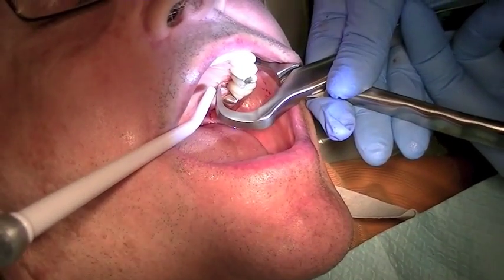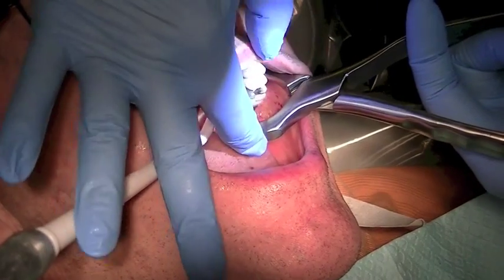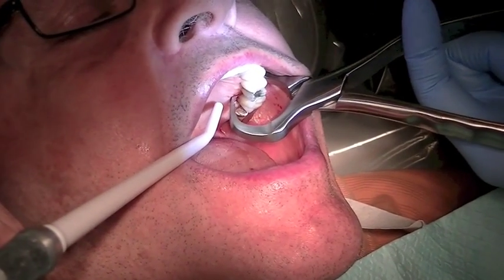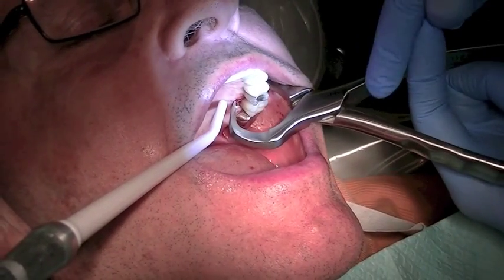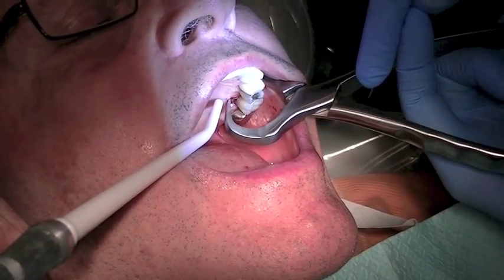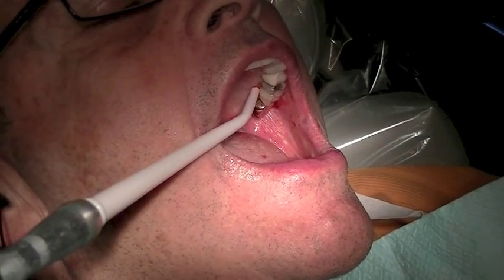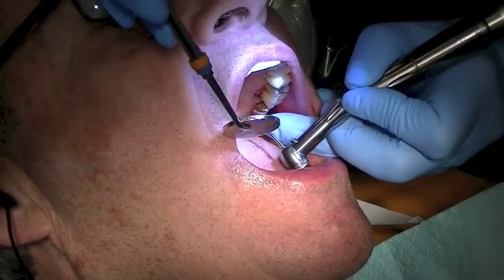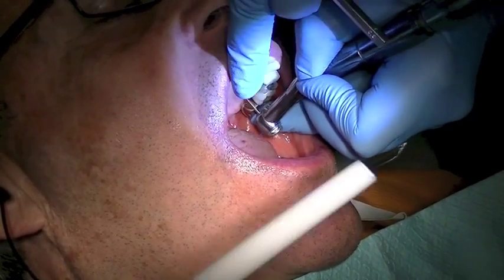So you see my positioning on the palate and my positioning on the cheek. I'm slipping a little on the palate into this crown margin so I'm going to take a burr and flatten the palate. I can use this surgical burr so I can get a better grip.